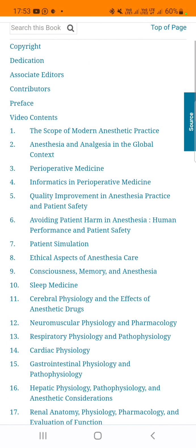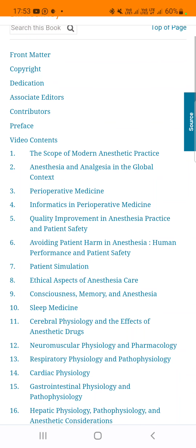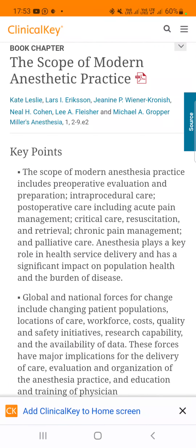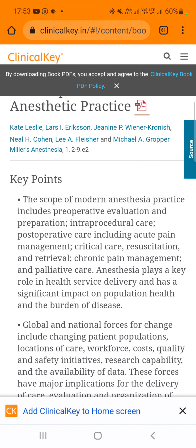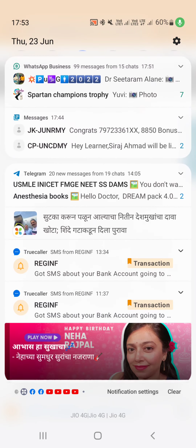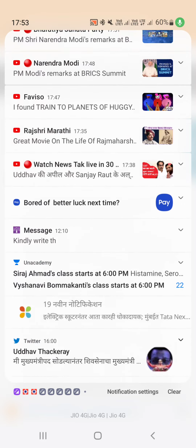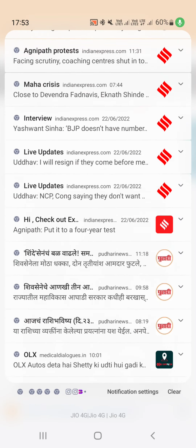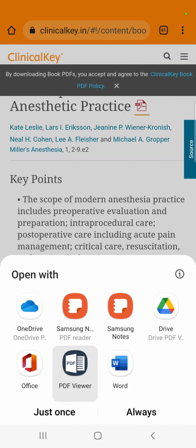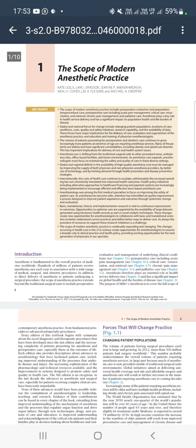Absolutely. So what is the patient position for the ablative procedures? Can the patient position protect from fluid overload to some extent? See, in the hysteroscopy, you have to keep the patient in the lithotomy position. I think there is no other option except putting the patient in the lithotomy position. True. Position itself cannot cause fluid overload. Madam, if you permit, I will tell a few things about fluid overload. Yes, please do.